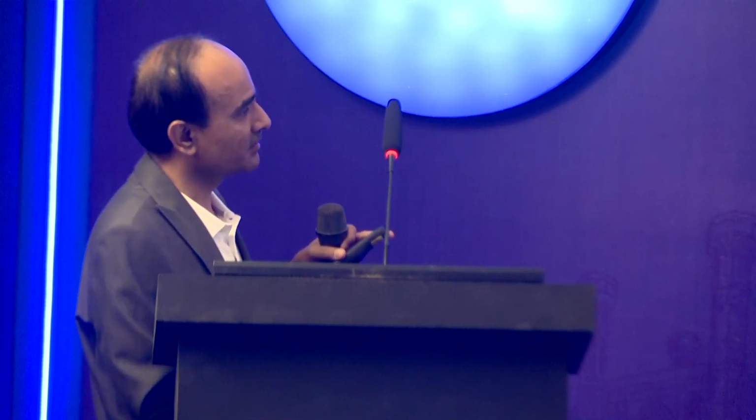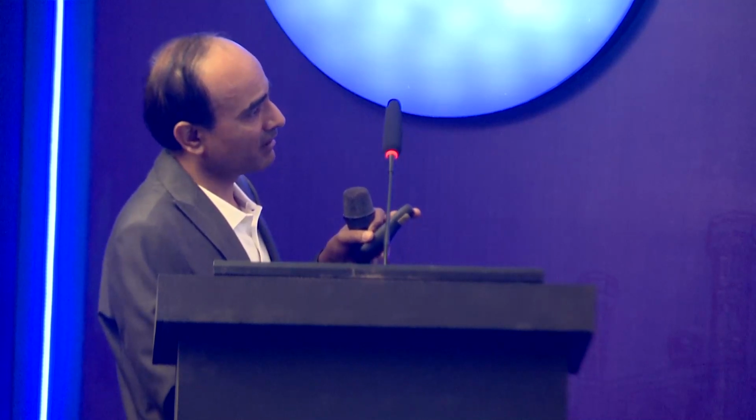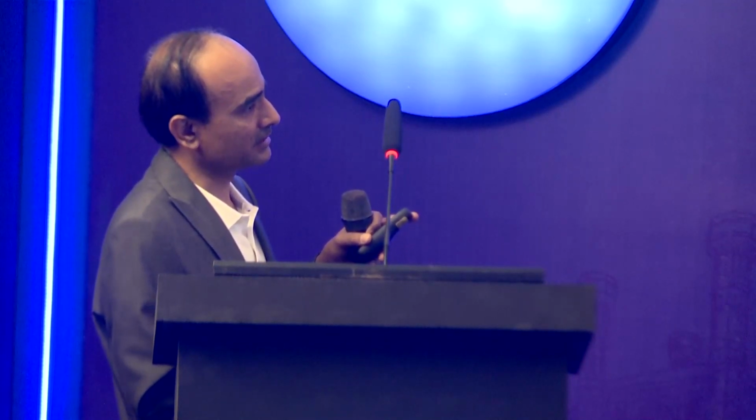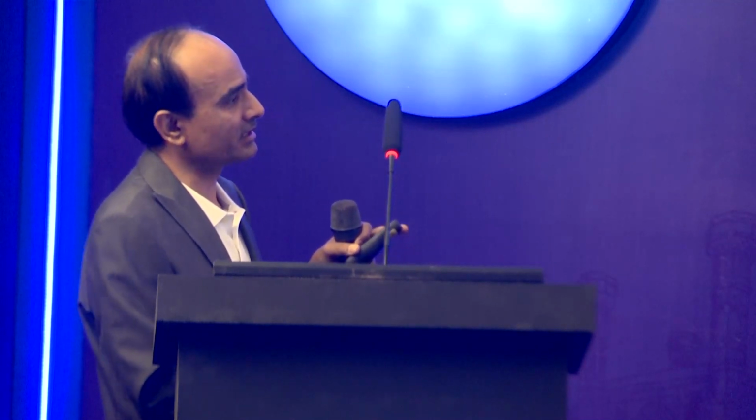And the story does not end. There are a couple of slides more, because when we reached the sheath, this one refused to go into the sheath. So we wanted to remove the sheath and the wire and everything. But luckily, we first pushed the wire all the way up to the axillary artery, and then we pulled this assembly, so that if we lose the balloon tip, the wire is still in. And that is what happened.